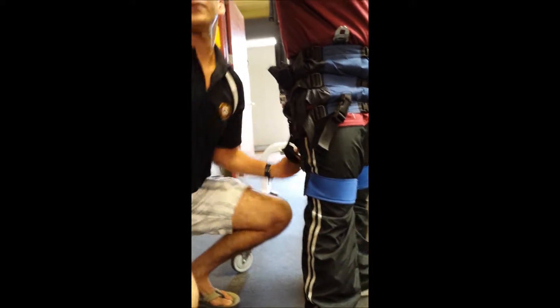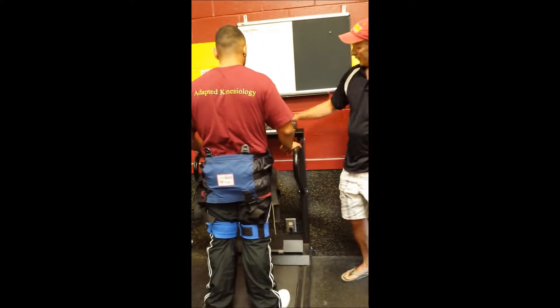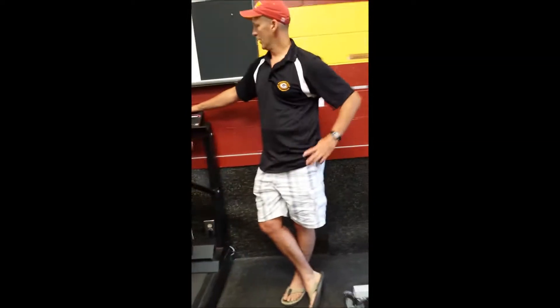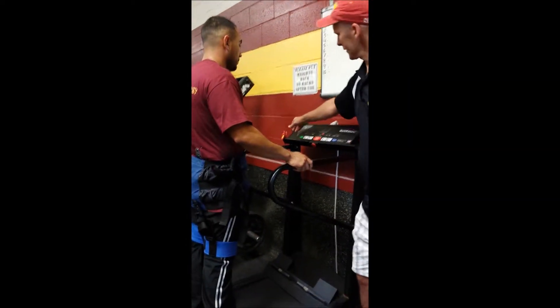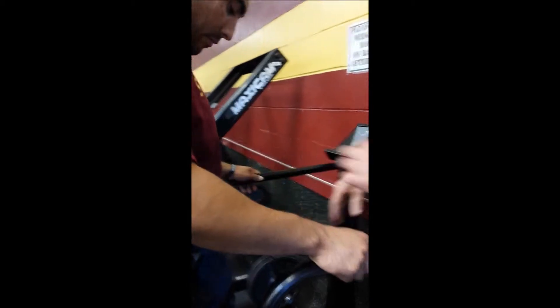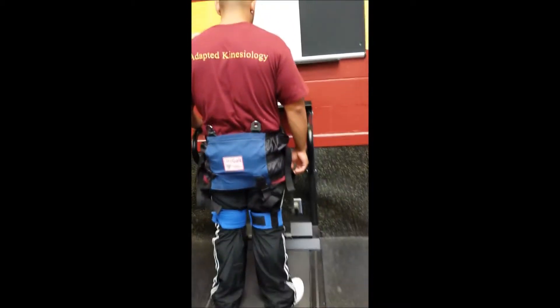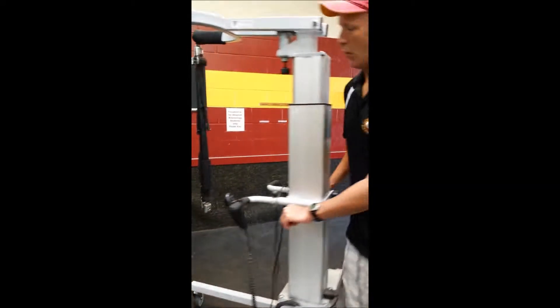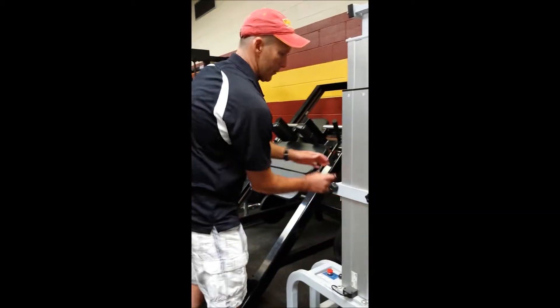Tim, go ahead and step up here. The treadmill Tim's on is also made by Lightgate. The benefit of this treadmill is that most treadmills start at 0.5 miles per hour — this one starts at a painfully slow 0.1 miles per hour. It also has an emergency stop button so that if the clip were to unhook, the treadmill stops. There's some redundancy in this system. I tend to use that safety clip more with folks who don't have partial body weight support, because I'm more worried about them falling with a moving belt.